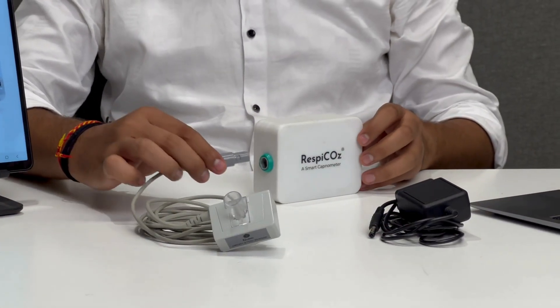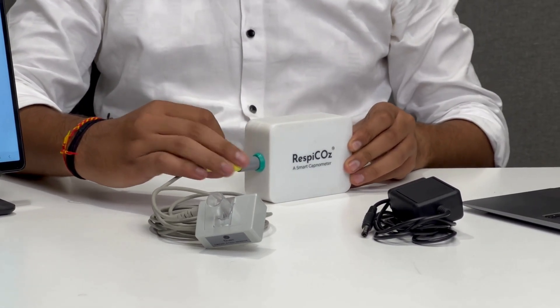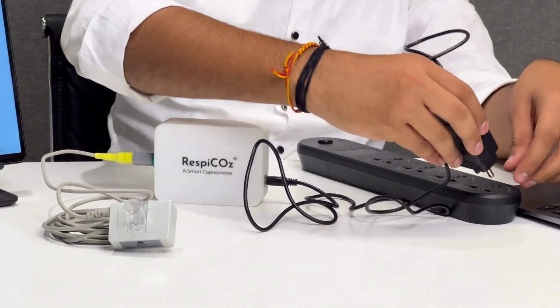Step 3: Now connect the sensor to the main device. Make sure it is properly attached. Step 4: Attach the power adapter to the device and turn it on.